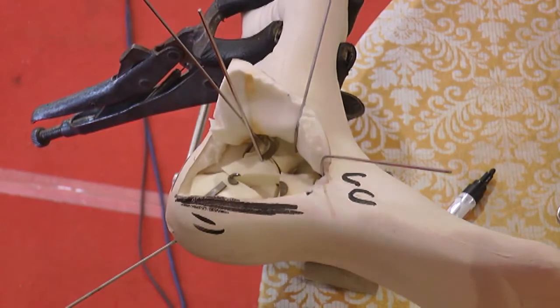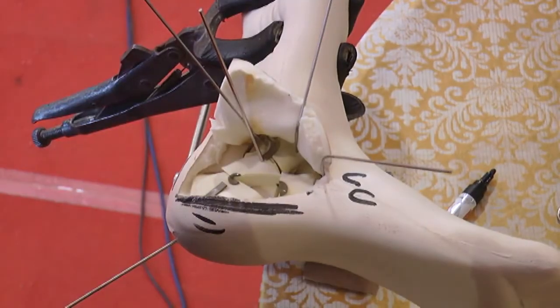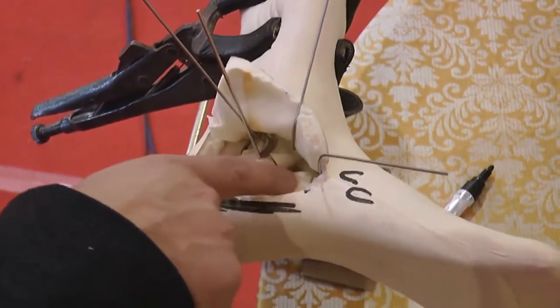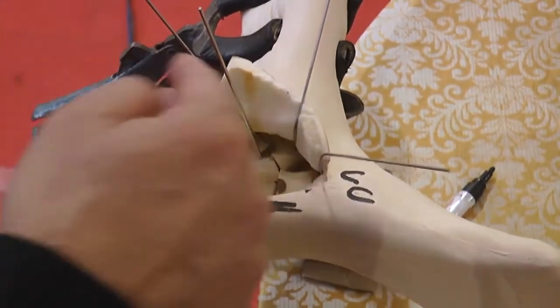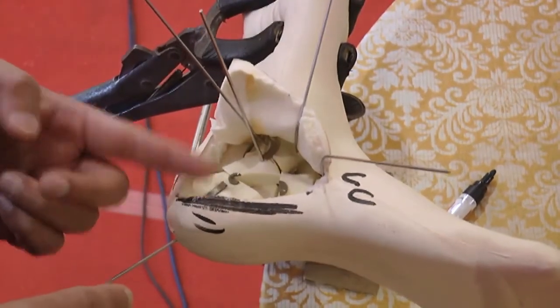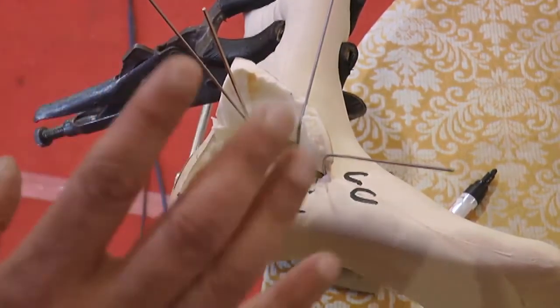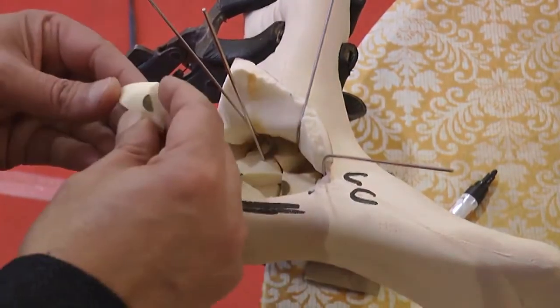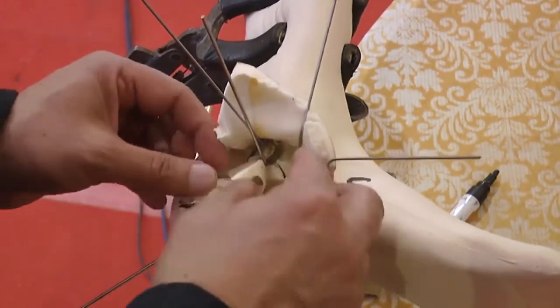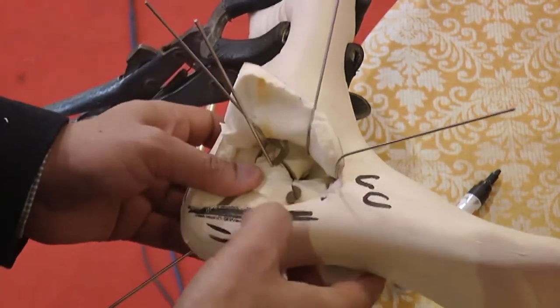So the tuberosity reduced, medial wall reduced, the lateral facet has been lifted up and reduced. At this stage, you need to look at the calcaneocuboid joint, and if there are any fragments or steps there and you need to put additional K-wires to stabilize them, you will do that. You can also, if your tuberosity has more fragments, fix the tuberosity to the anterior process by a separate wire before depositing back your lateral wall blowout, and then finally the plate goes in. So that is the lateral wall blowout, which has been now put back.